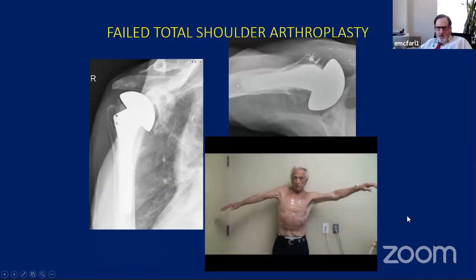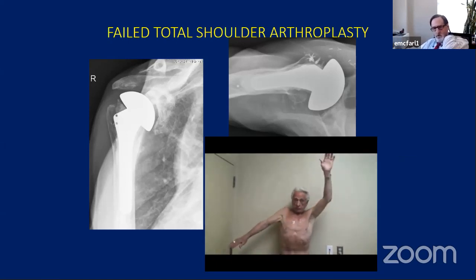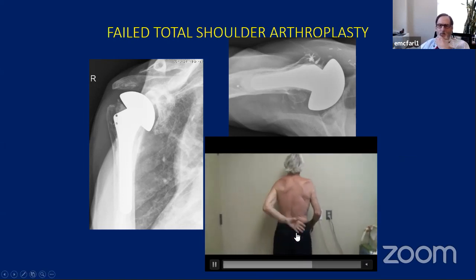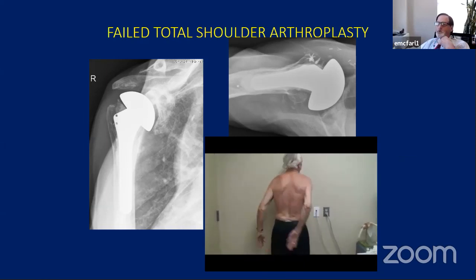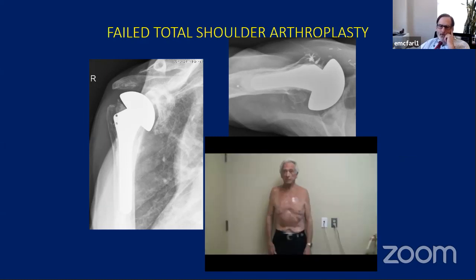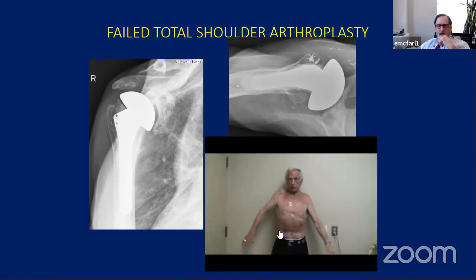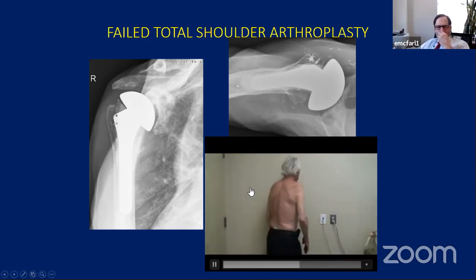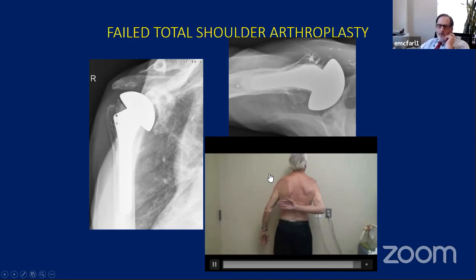So here's another example of how this operation, how reverses have helped other indications. This is a guy, he's a retired plastic surgeon, and he's had 7 operations on his shoulder. So he had a hemi, and then he got a total, and then that failed. So they put in another hemi, and that time he got a brachial plexopathy. So they went in and explored his brachial plexus, and they also did a coracoid osteotomy to try to stabilize the shoulder. And so anyway, here's his range of motion.